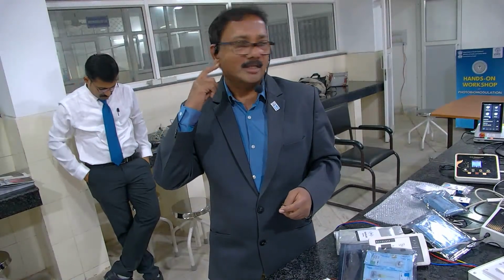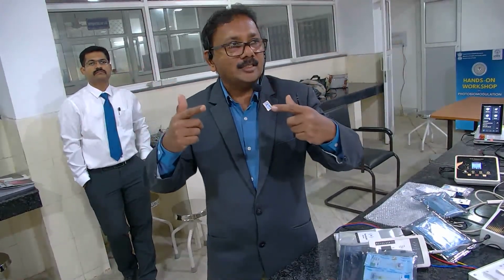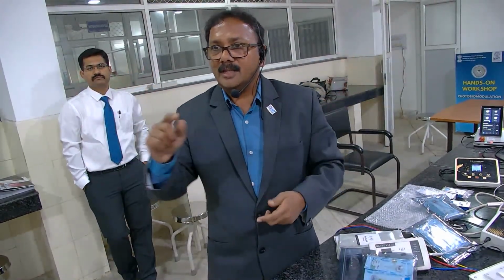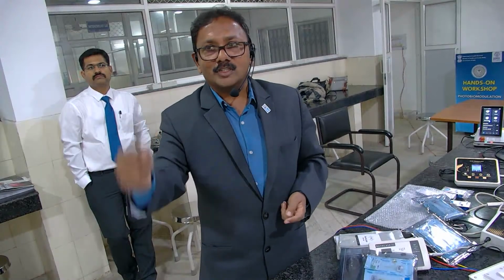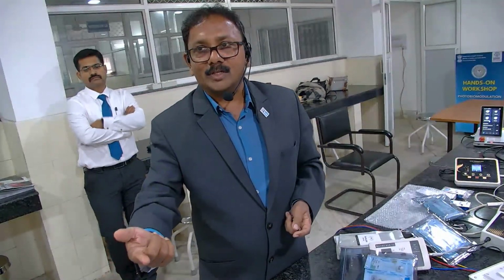Evans will be telling you in detail. One will be there, second will be from this one, and third will be intraorally. So you are making the laser energy attack from all three sides. That we'll again discuss after Dr. Chandrasekhar Agarwal's class. If you have any questions, we'll come back to that.